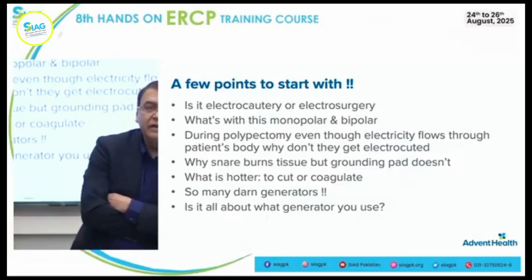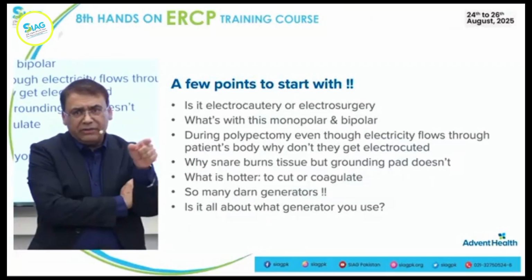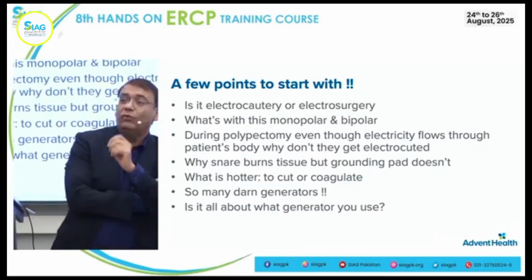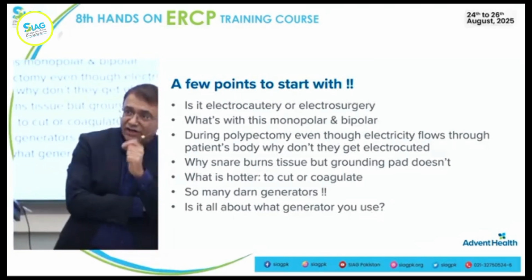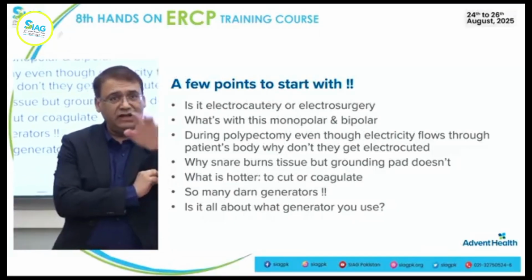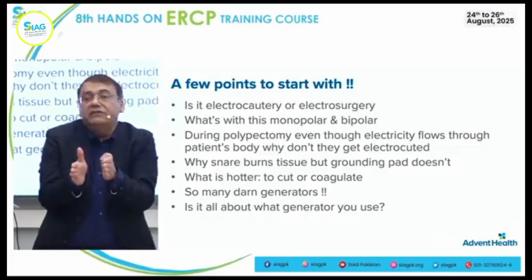It's the what? Grounding pad. Grounding pad and what? High frequencies. Okay. It is not causing arrhythmias. Why is it not causing arrhythmias? There is no nerve stimulation. Why are they not stimulating? Because of high frequency. Yes. So it's not a pad. The first answer is always the pad, whoever gives it. So that's not it. It's the frequency.